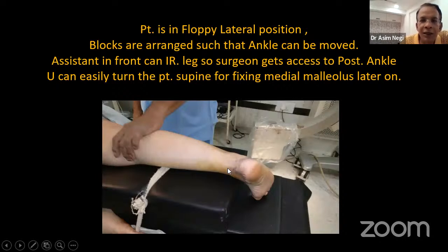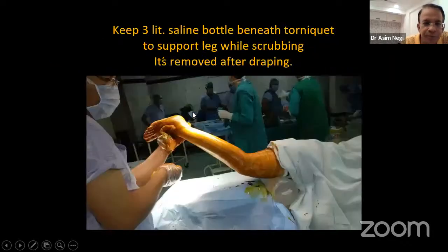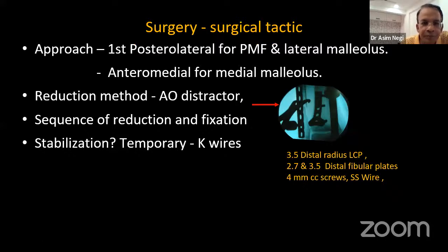My blocks are arranged such that the ankle can be moved in plantar flexion and dorsiflexion, or if I want, I can put the ankle anteriorly. An assistant in the front can internally rotate the leg, so the surgeon gets access to the posterior aspect of the knee and ankle very easily. Later on, once I have finished the posterior malleolus and the lateral malleolus, I can easily turn the patient supine for fixing the medial malleolus. This is a 3-liter saline bottle which we keep below the tourniquet. It helps immensely in scrubbing the patient and getting the patient draped, and you can remove it after draping.